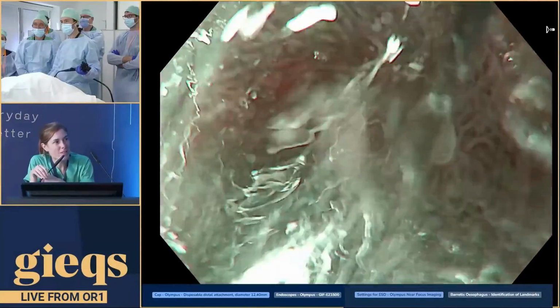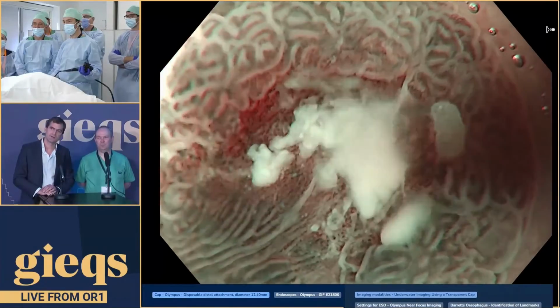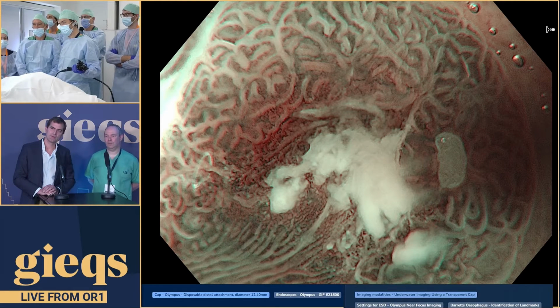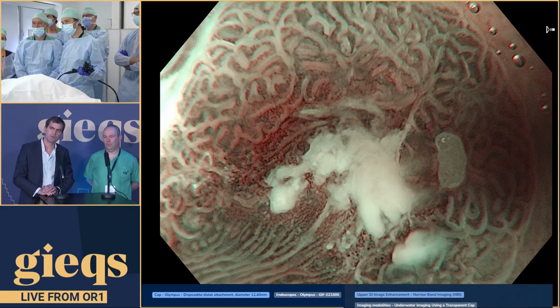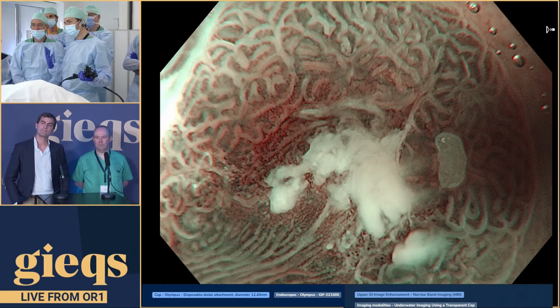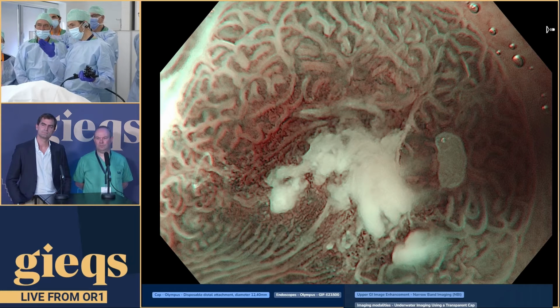I know you wanted to say something. No, it's very interesting, the vision we have now with the near focus, because the discussion to characterize that as a biopsy scar, when you are just using the near focus now, clearly it makes the difference, because you see all those corkscrew vessels in the middle around the fibrin area, and this is what you see in superficial cancer. So there is no more doubt when you use this near focus in this area. I mean, Michael, I think like the water, for me, it just makes it all sit up a bit more. But whatever, like what you see there, I mean, can you describe that for people? So if I'm thinking it's a biopsy site, then that's just that bit in the middle, right?